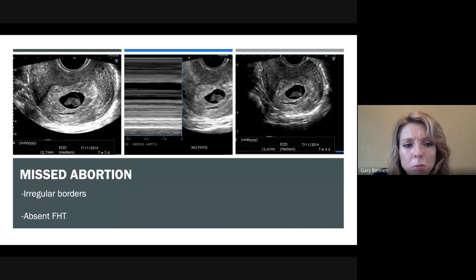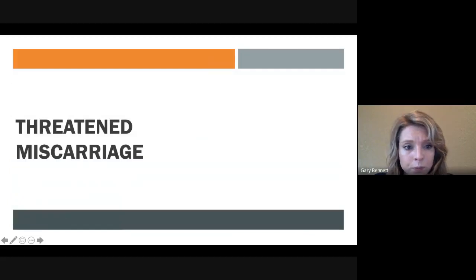Again, I think that's probably something that you develop after doing a lot of these ultrasounds. But even just after looking at quite a few pictures of them, you'll start to notice when things just don't look right. And then, of course, you're going to want to spend some time looking for that fetal heart rate, but we're not going to find it in this picture.